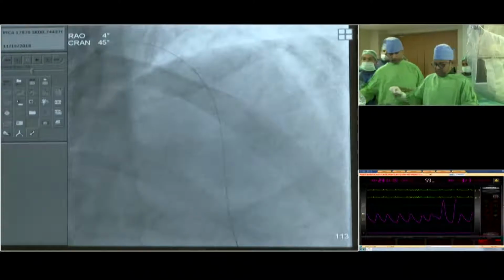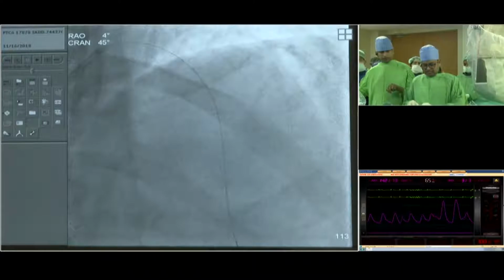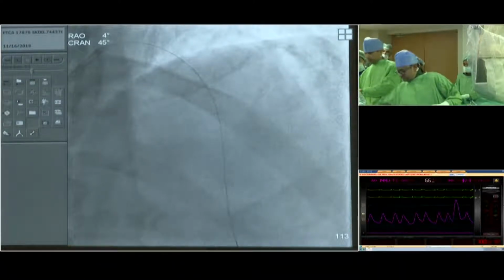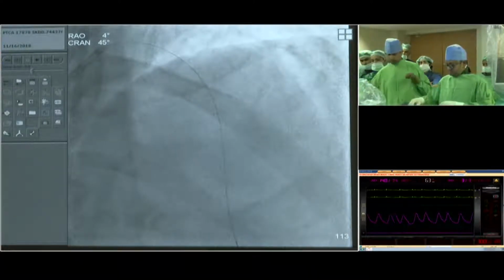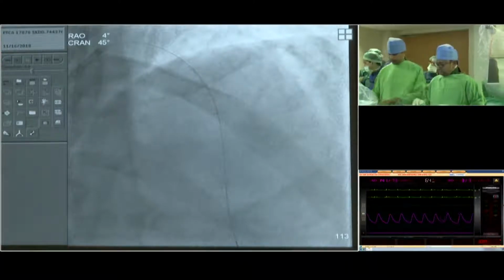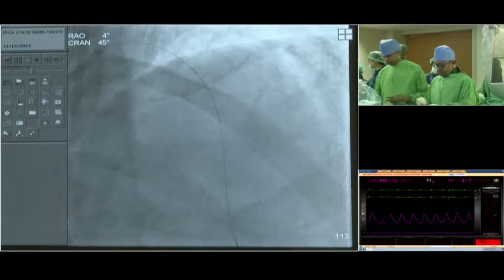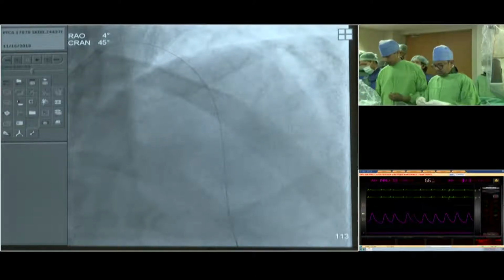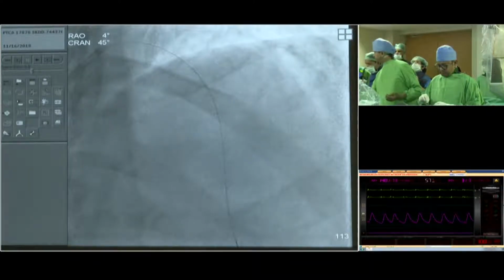We do an OCT and check. So we'll do an OCT imaging and then see whether we need to go up. How many of you feel that we should do 3.5 millimeter dilatation beforehand? We'd like to do a 3.5 dilatation in the proximal part of the stent. Raise your hands. Yeah, very, very few people. So let's do an imaging and then see if this is required. 3.5 is probably reasonable, or 3.25 at least. The OCT will tell us. Anurag, we are ready with this.